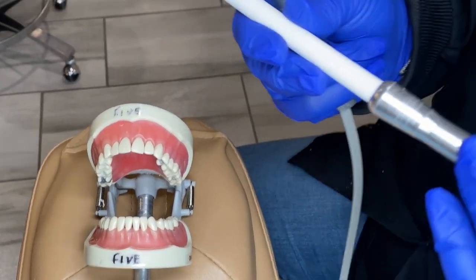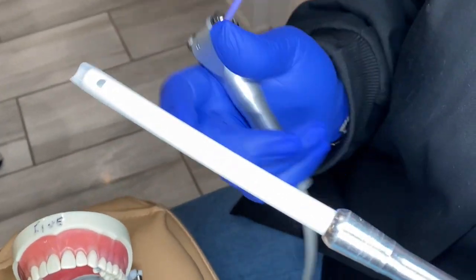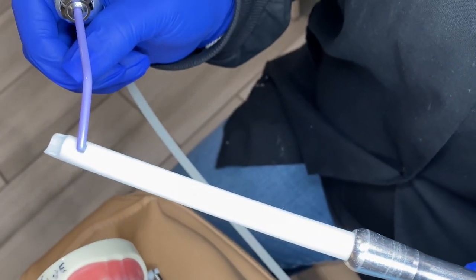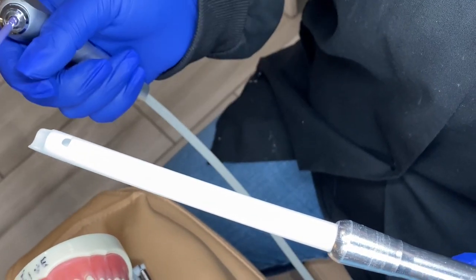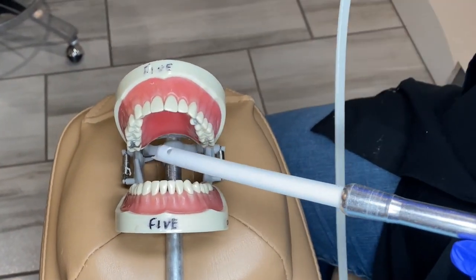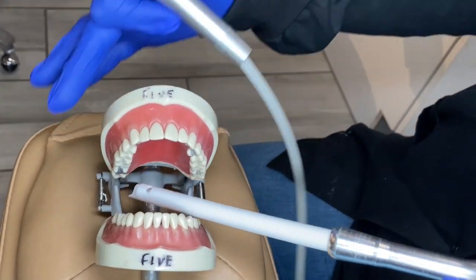Today we're going to be going over the placement of your HVE — high volume evacuator. There's a little window on it to help collect more water or debris. We'll start on the upper right.